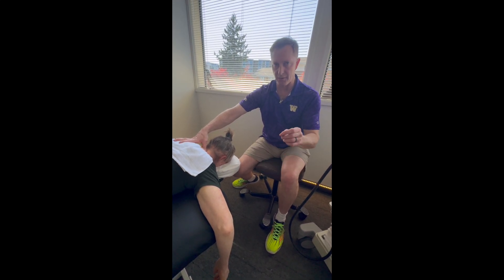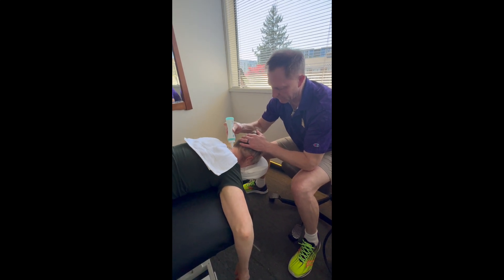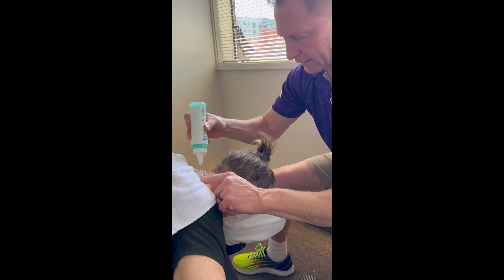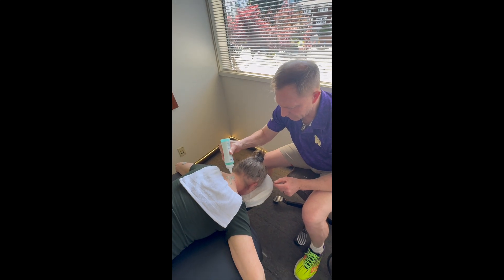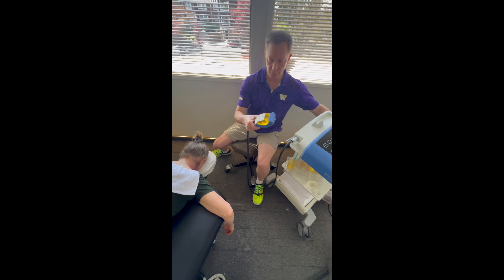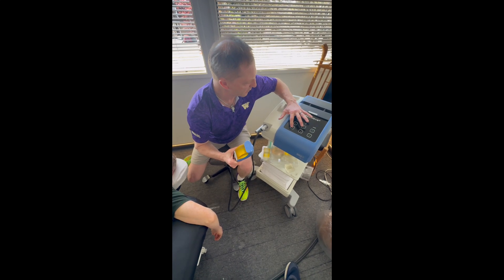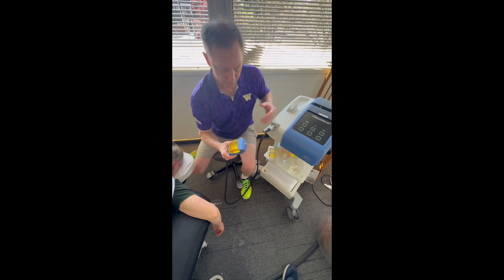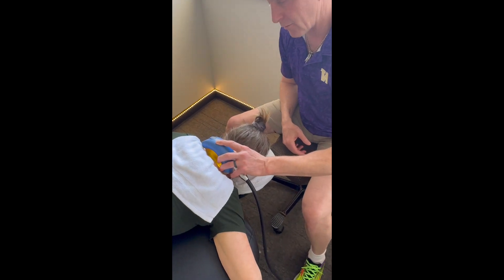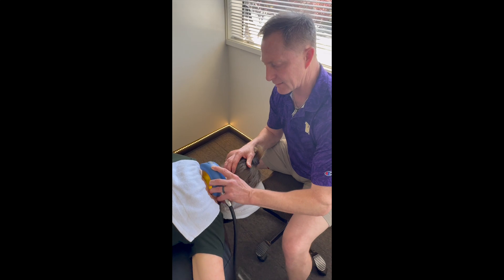There should be some pain involved — enough to let the patient know, hey, this is working, it's where we want it to be. I'm going to use some gel here and work into the shoulder blade and spine area. There's going to be some clicking and noise. I started at a pretty low setting. Unlike regular therapeutic ultrasound, you don't actually rub this around much — it's much less movement than a traditional ultrasound.